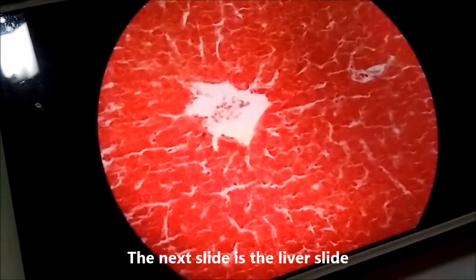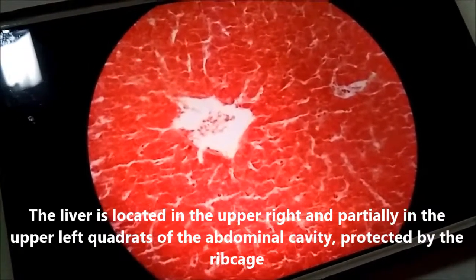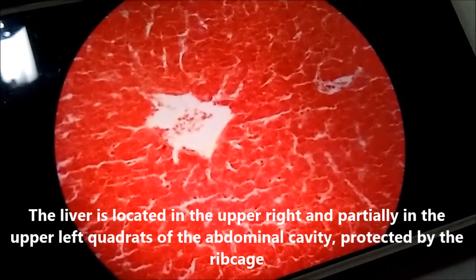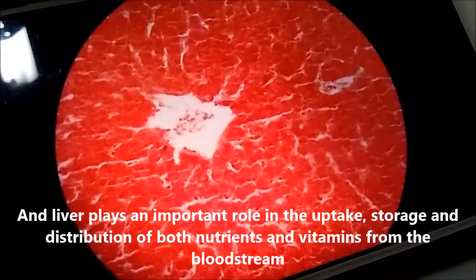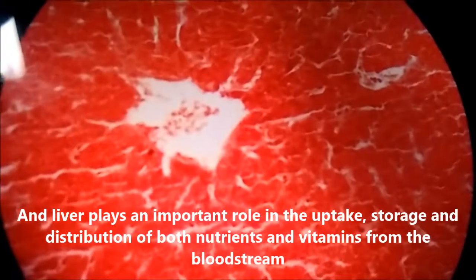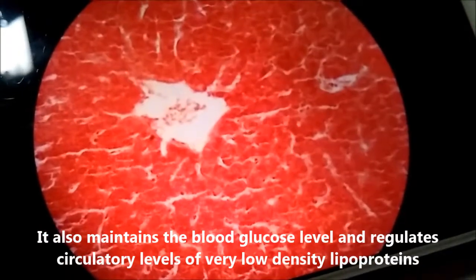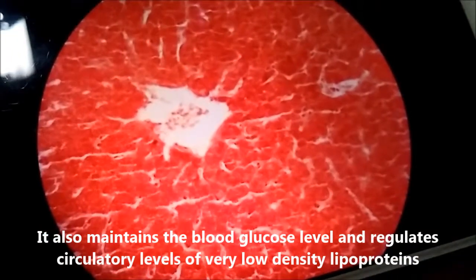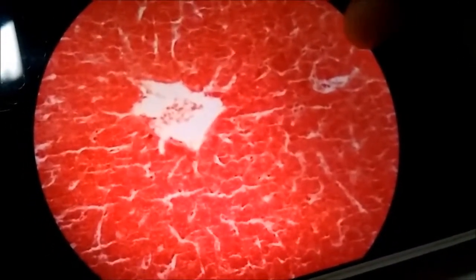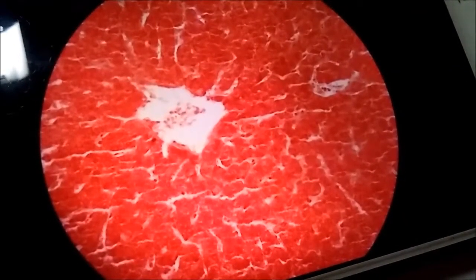Okay, the next slide is the liver slide. The liver is located in the upper right and partially in the upper left quadrants of the abdominal cavity, protected by the rib cage. The liver plays an important role in the uptake, storage, and distribution of both nutrients and vitamins from the bloodstream. It also maintains the blood glucose level and regulates circulatory levels of very low density lipoprotein. As you can see here, this is the structure of the liver after we observe it under the microscope.